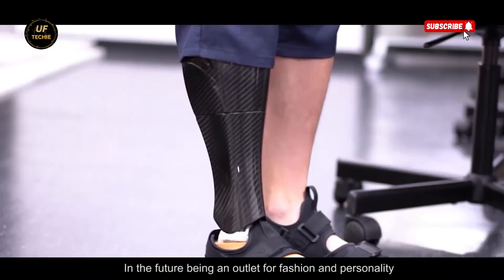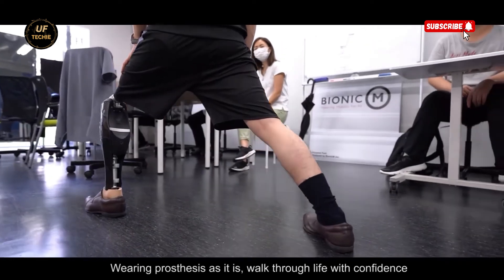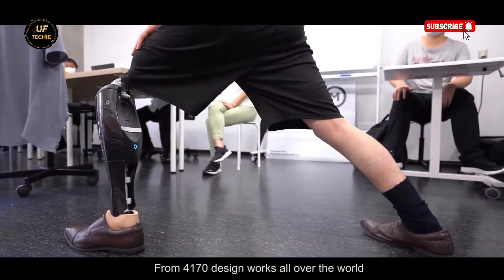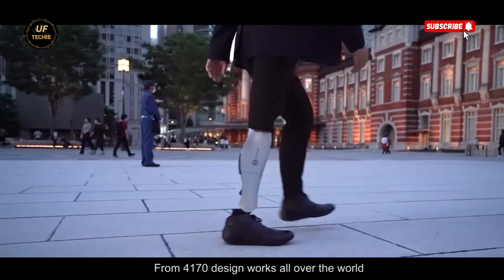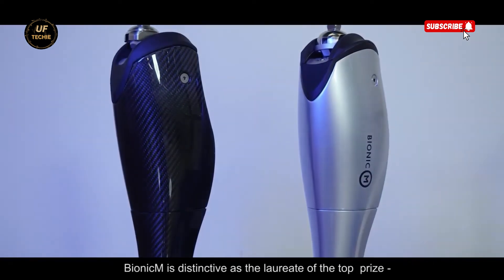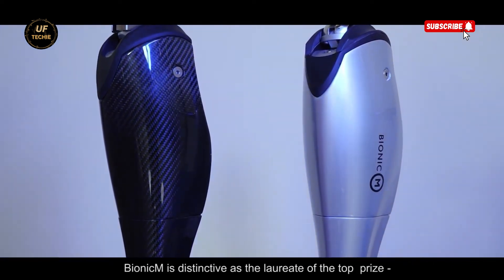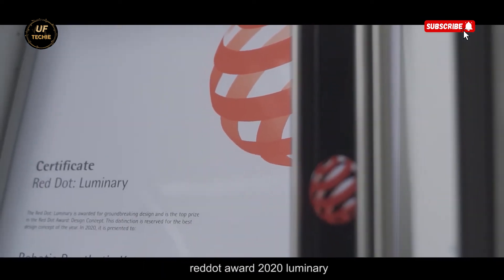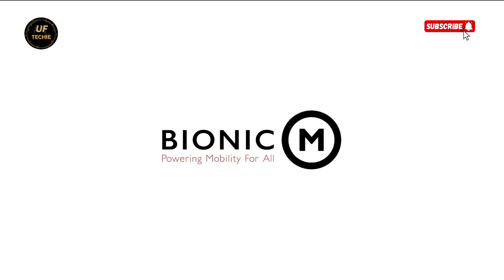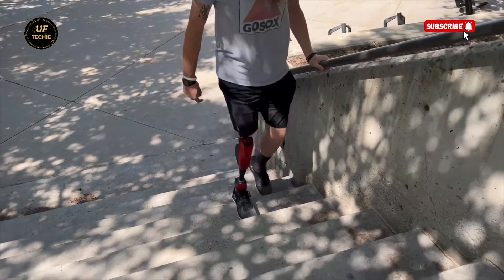Even in unexpected situations, like a sudden power loss, the leg doesn't stop functioning. It seamlessly shifts into a passive mode, similar to traditional prosthetics, so users are never left stranded. The prosthesis also includes automatic assistive extension, which helps extend the leg naturally during walking — especially useful for reducing stress and fatigue on the intact leg. This feature dramatically improves balance and posture, making everyday activities easier and more comfortable.